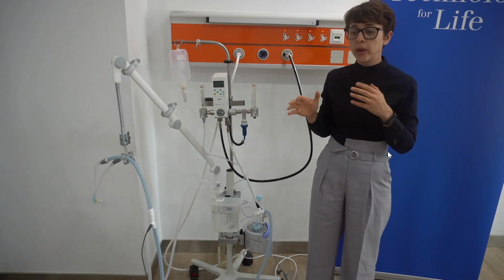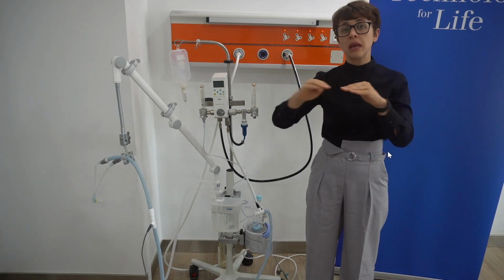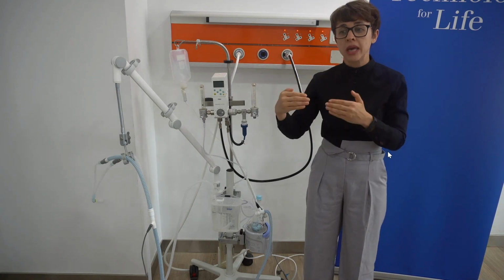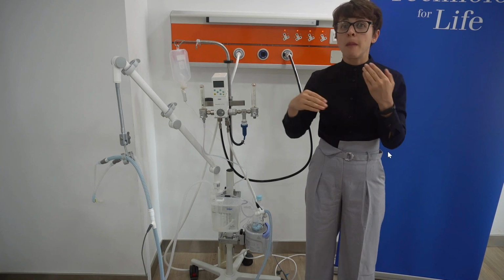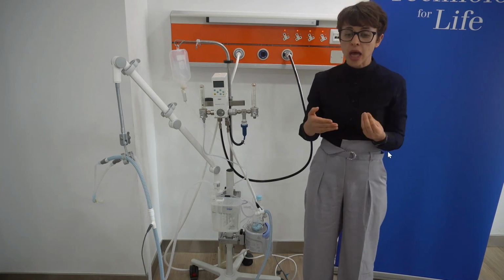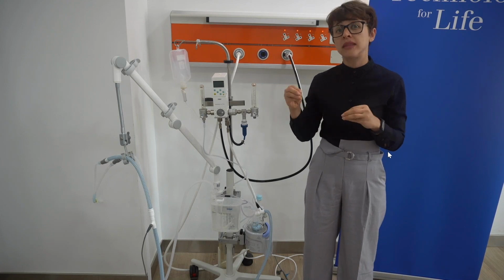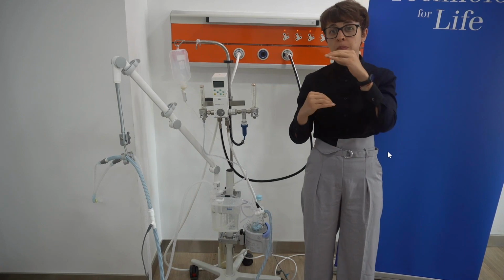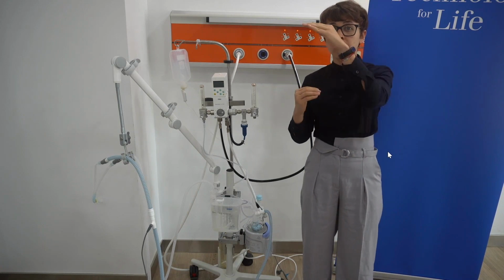we are trying to maintain the same type of pressure. The idea is that the PEEP is going to be the same, but there's also the risk, if there are challenges with exhalation, that the baby will develop an intrinsic PEEP, and the total PEEP might be higher than the CPAP.